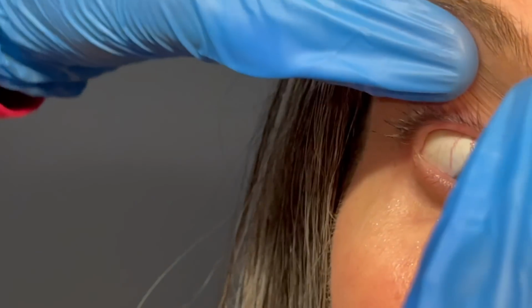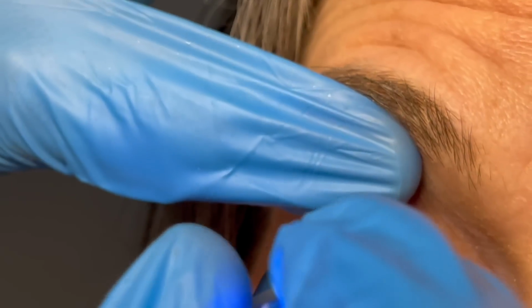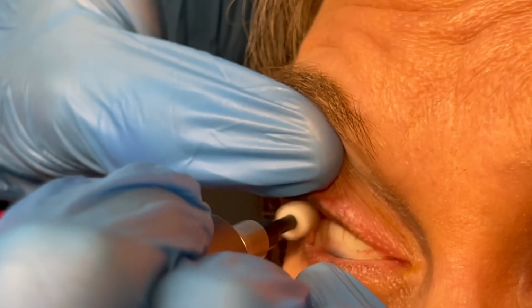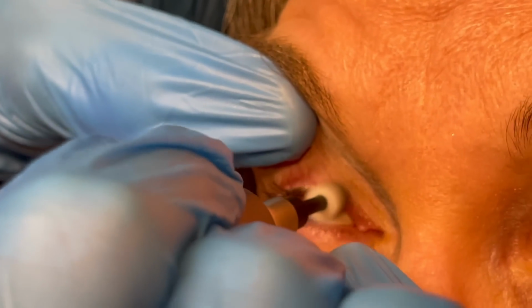Ready for eyelid number 2? All right, look down toward your toes for me. Keep looking down. So it just skirts along the outside of the eyelids, the eyelid margin, removing some of the biofilm. Like going through a car wash for your eyes in a way.